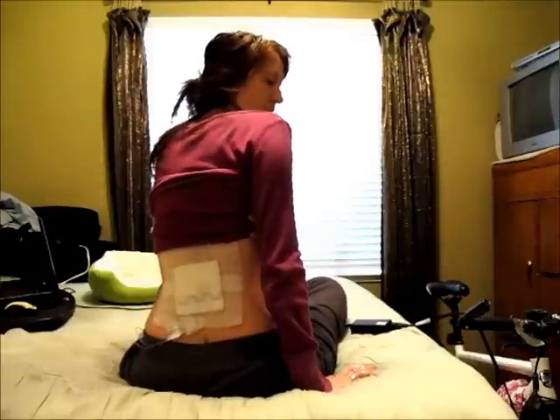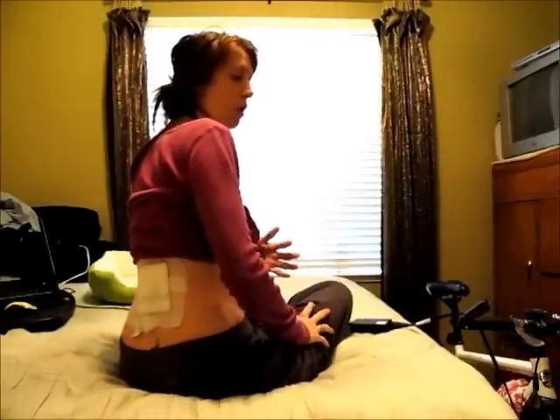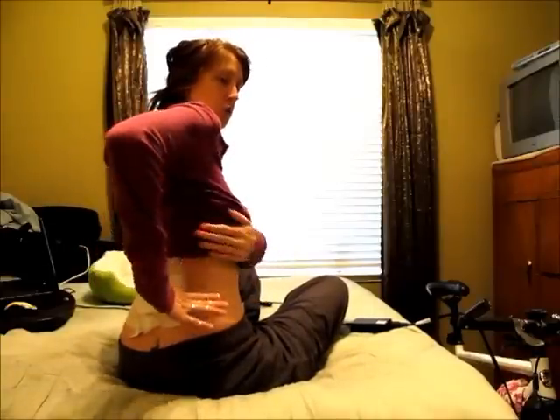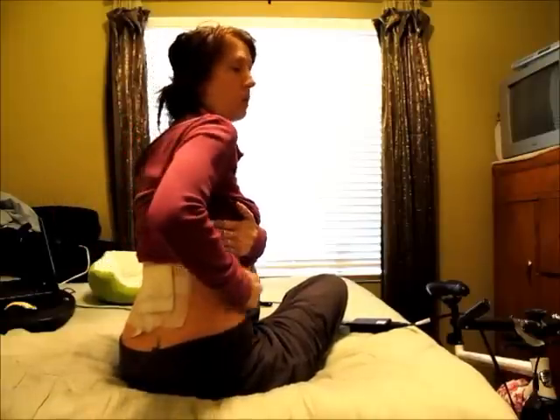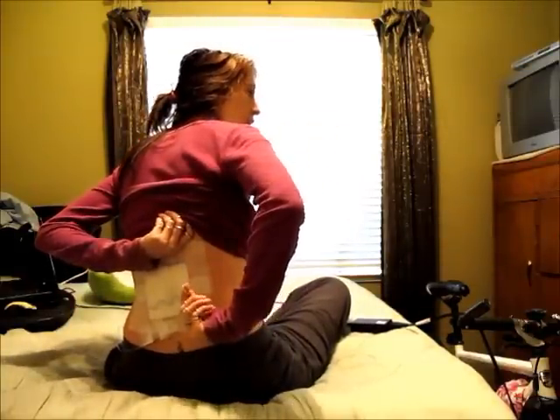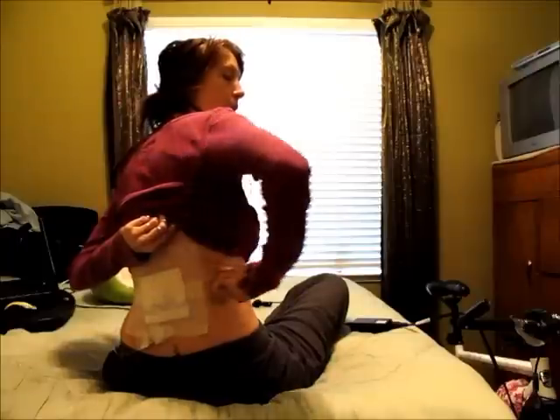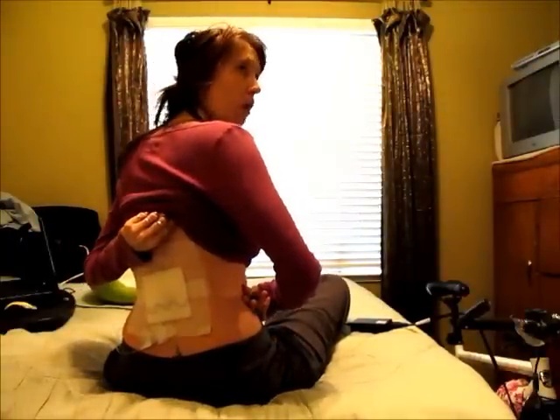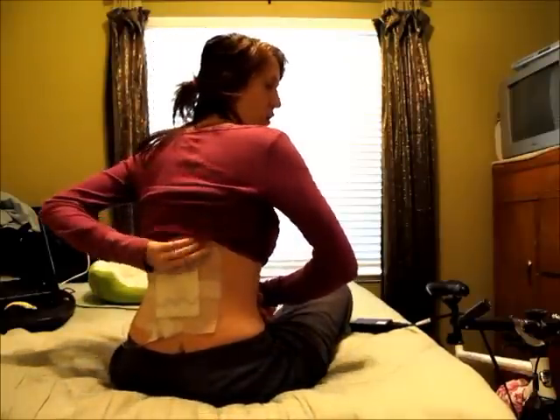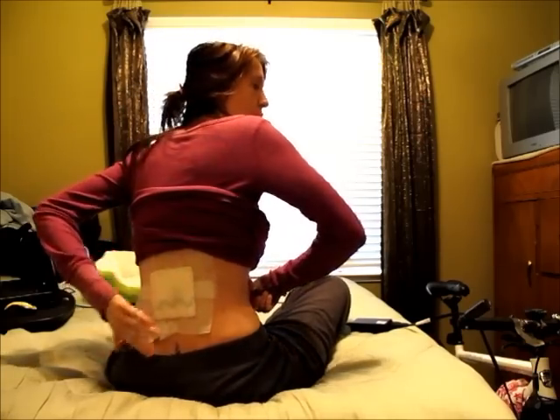Normally when they use a spinal cord stimulator, they will tend to treat a specific pain, like arm pain or leg pain, or a pain that's in your lower back region. But to get a stimulation that will treat a pain in your flank area that wraps around is really difficult. So what they did is they stuck the leads up there, and they kept pushing them in and pulling them out and stimulating them, turning them on and off to try and get them in an area that would wrap around in the location that it should. So it took a lot longer than a normal spinal cord stimulator trial procedure would take. When all was said and done, they were able to get the stim to kind of go in this area. And so we patched me all up.